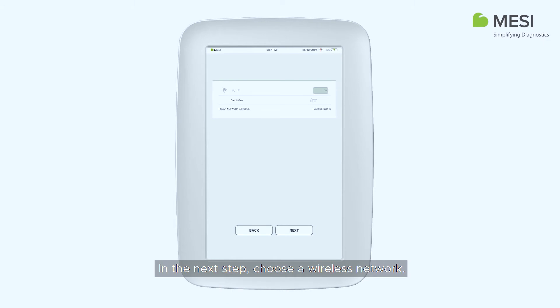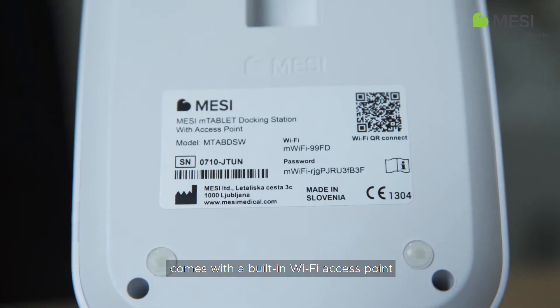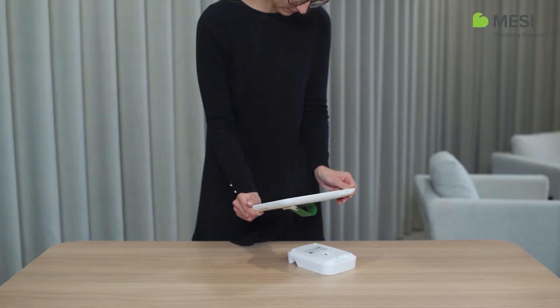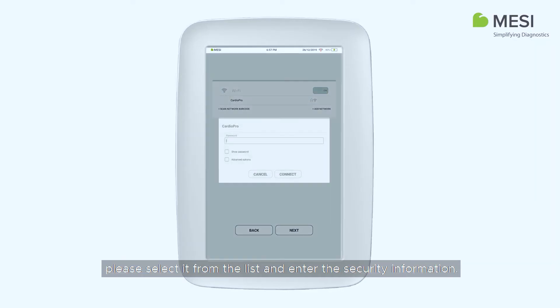In the next step, choose a wireless network. The docking station for the Macy M-Tablet comes with a built-in Wi-Fi access point, to which the tablet can be connected by scanning the QR code on the back of the docking station. If you would prefer to use a different wireless network, please select it from the list and enter the security information.